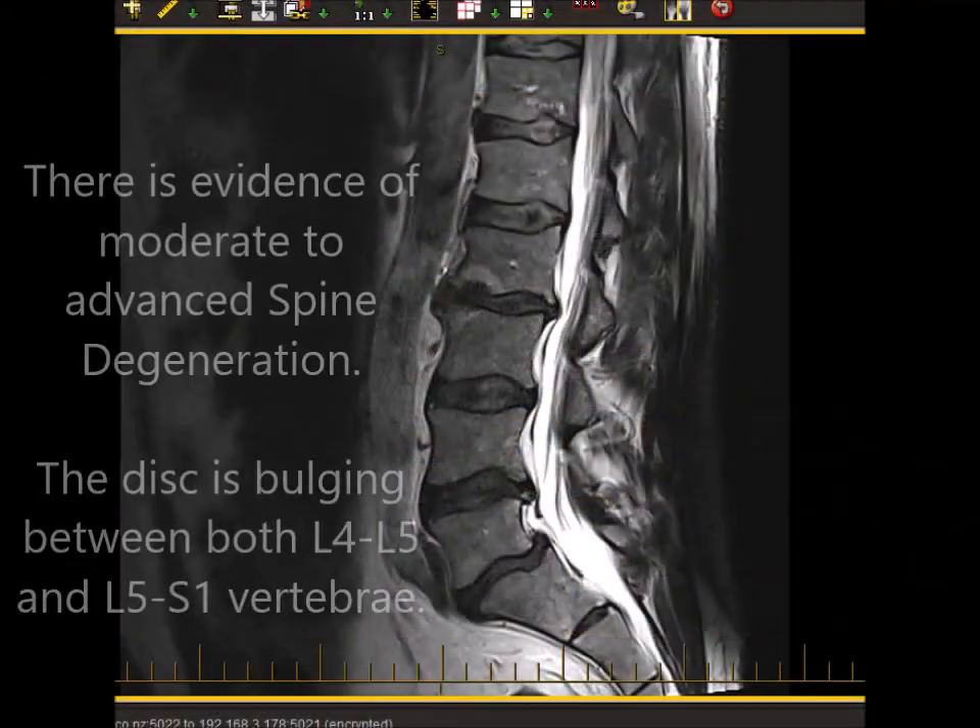We don't always get the best results but we try our best, and it all just depends on how far advanced the injury is. So there we go — we've just dropped into there to create that third leg of our treatment. We've finished the adjustment and what we did is we focused on trying to decompress the lumbar spine using the flexion distraction table.